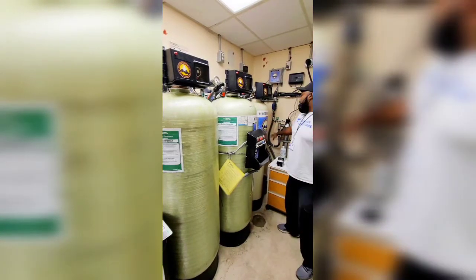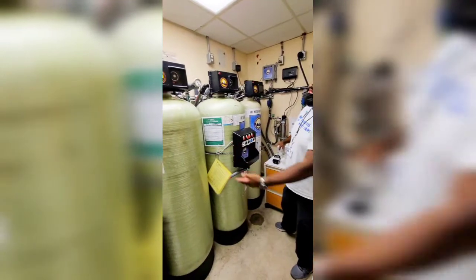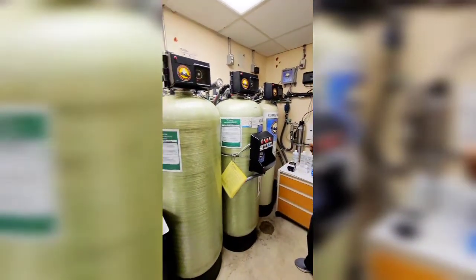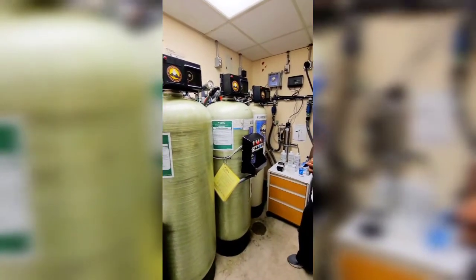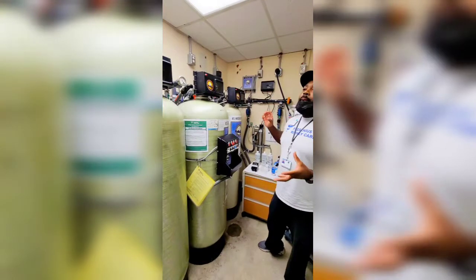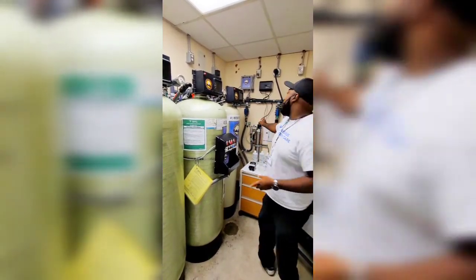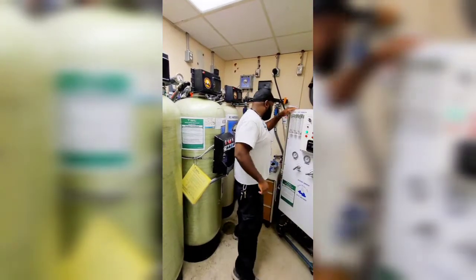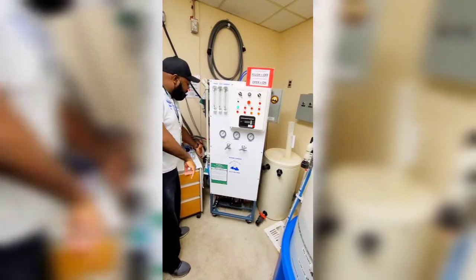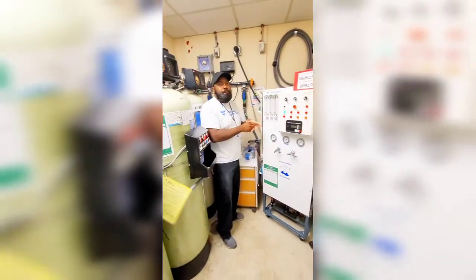Going through these tanks, you've got a multi-cartridge tank down here — that's another sediment filter just like that one. Any more dirt or particles in the water, it'll grab that out of there as well. Then you've got a UV lamp — it's like a purification for the water, like what UV does in a hospital. So it goes through there, then comes to a pre-sediment filter. Again, just like that one over there — whatever else is left, it grabs before it gets into the RO membrane.